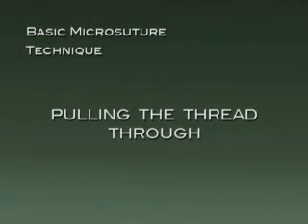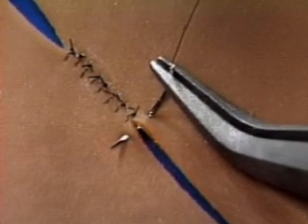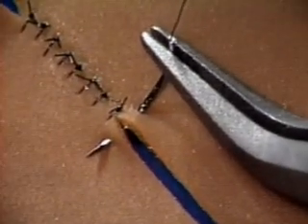That's a lot easier on vessel wall than on rubber, because you have the adventitia to hold on to. One way not to pick up the tissue is to grab its full thickness like this. If you do that to real vessel wall, you'll cause serious harm. Now that we've looked at all those potential mistakes, let's get back to where we were.